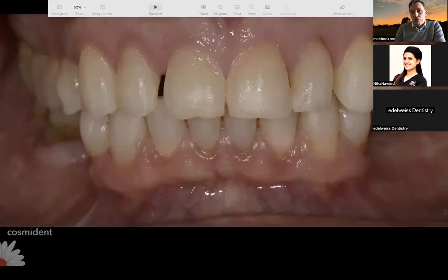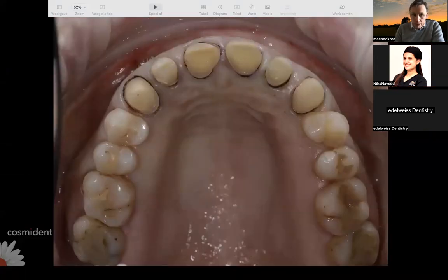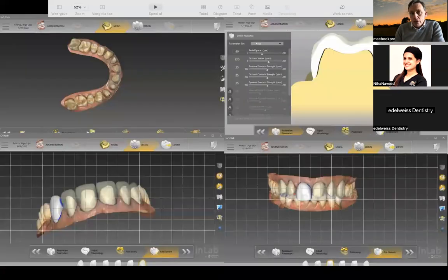because she asked to go for the full preparations. She didn't like her teeth, and she wanted to get them restored finally as totally new teeth, and that's the reason why we went minimal. We went for a full contour crown, like we call it. That's what you see here. We did these preparations and the intraoral scanning. Based on the intraoral scanning, we design the crowns. This is what you see here in the software.